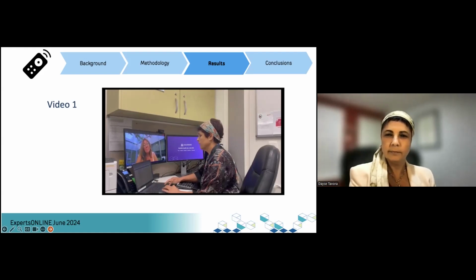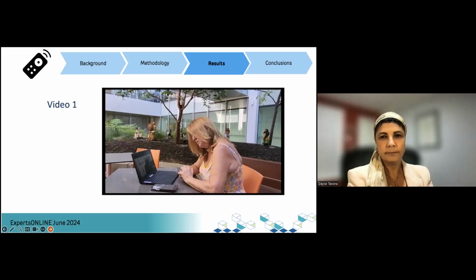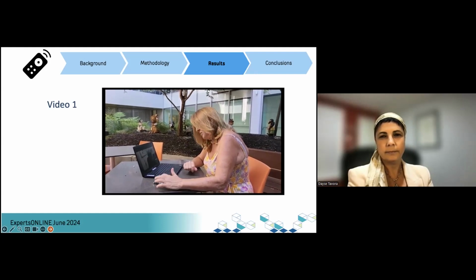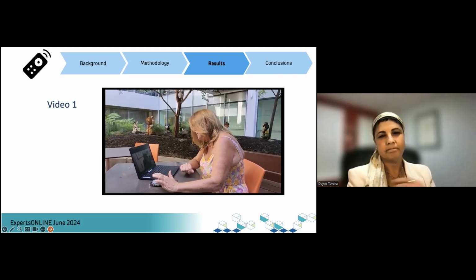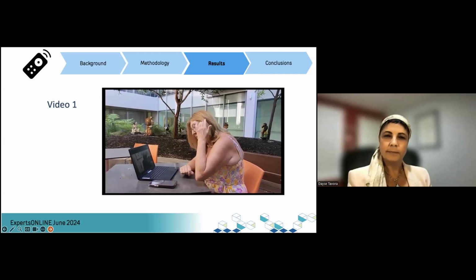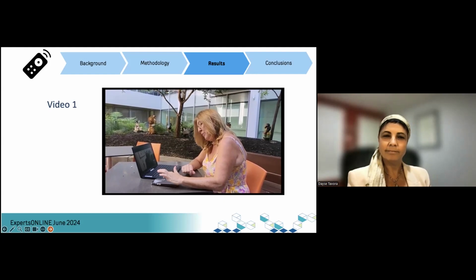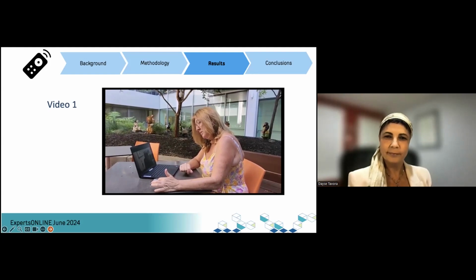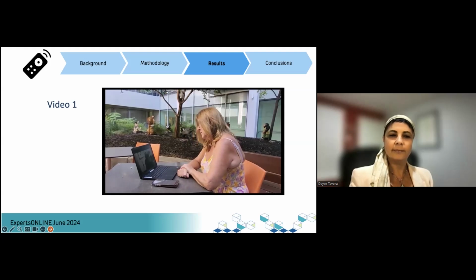All right. So now what I'm doing is I'm uploading the new setting for you. Yes. Yes, just that. Yes. And then it should show you that there's a new configuration created today. Install new configuration created today. Do you want me to press that? Yep. Just press that. Done. Yep. Is it all done?